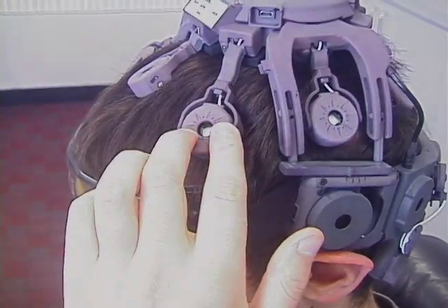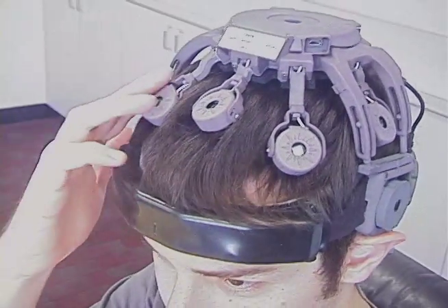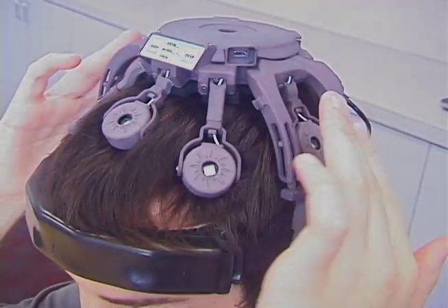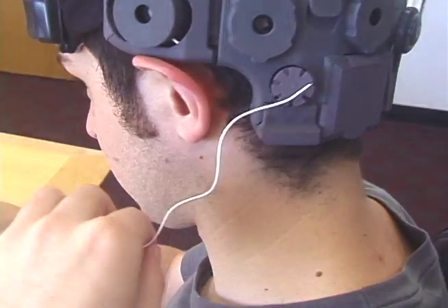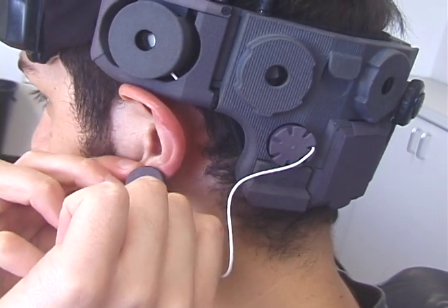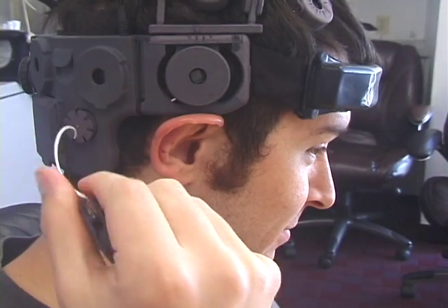Rotate those sensors — which are only making contact on their edge — so that they make full contact with the scalp. The ear clip electrodes are at the back of the headset. Unspool the lead and clip the electrode to the ear lobe. Do this for both sides.